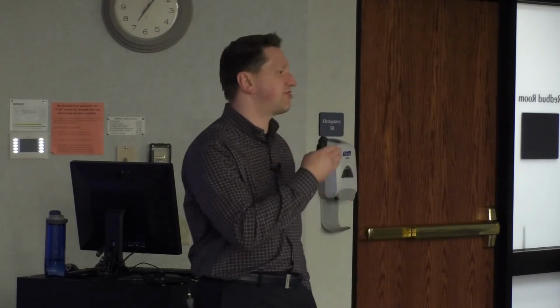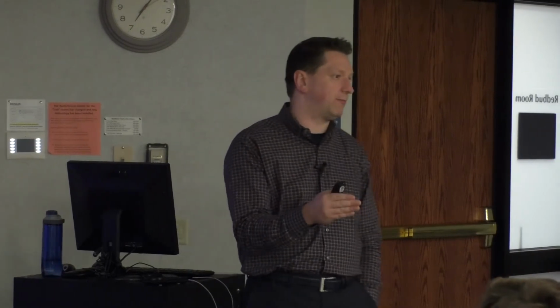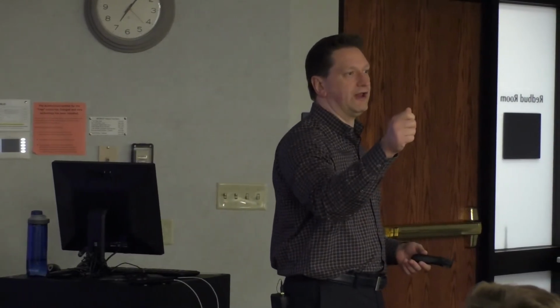Same thing with room clearing, okay? Not all the squads are going to teach room clearing in the exact same fashion, right? But they are all going to have a methodical way to do it so that every single member of that squad knows exactly what every other member is going to do. Same idea here. You have to have a system to look at the EKG so that you don't miss critical points. Because it's not until after you've read 10 or 50,000 of these things that you can just kind of hold it up and go like, yeah, it's this, and throw it away, okay? I mean, it really does take that long.